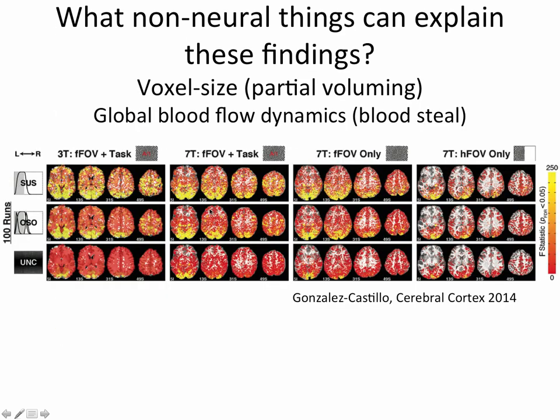And you can see, this is one volunteer done with the exact same task. I'm not sure if you could see this, but once we have the smaller voxels, things are much more constrained to gray matter than they were in the initial study. So it pushes us more toward this really being primarily a gray matter effect.